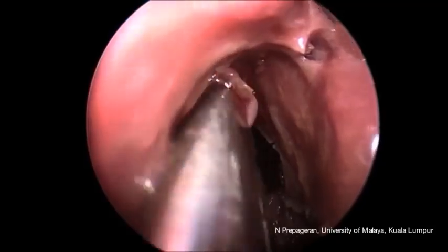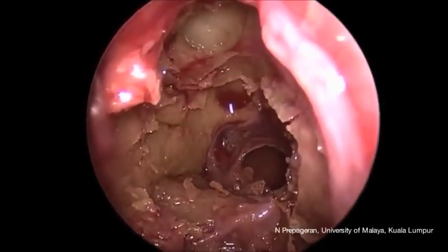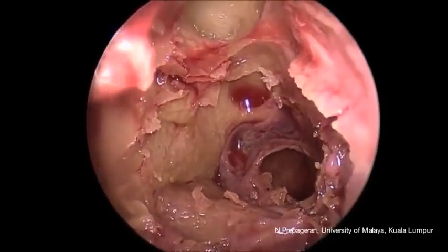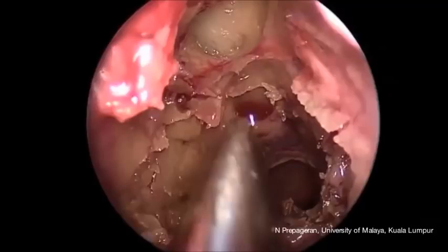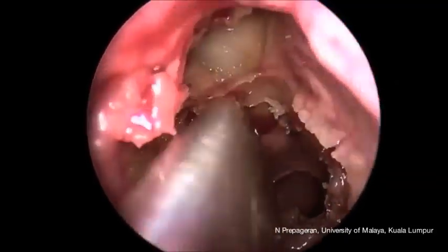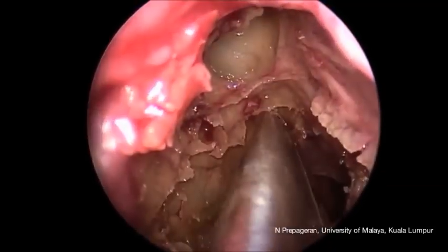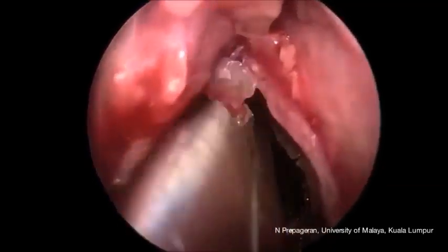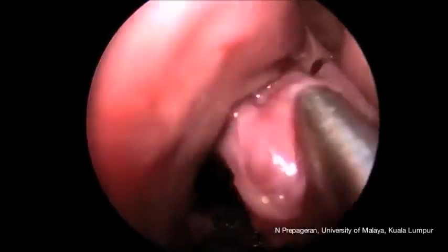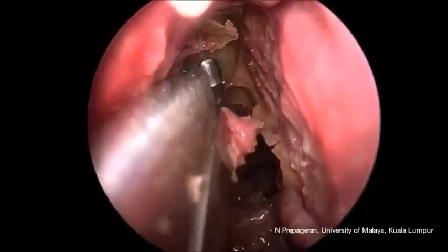so that we can identify and visualize the anterior ethmoidal artery. This is more for dissection, and there you go. A very nice view of the anterior ethmoidal artery, the frontal recess, and you can see very clearly now the posterior wall of the frontal sinus, which always bulges out like a tummy, which is actually the bulge from the frontal lobe itself. Again, I'm removing all the mucosa so that we can have a very nice view.